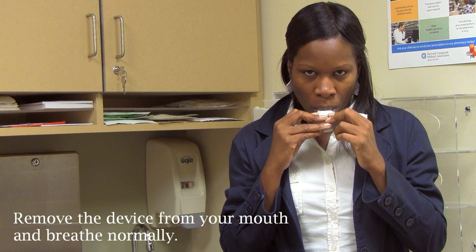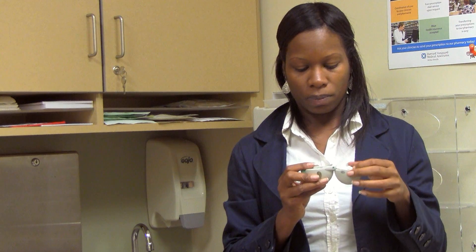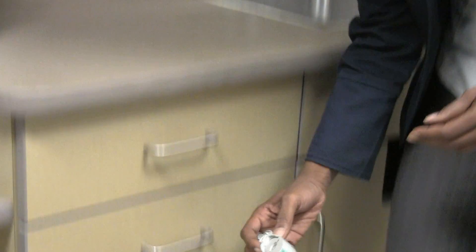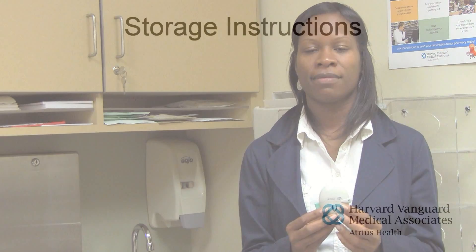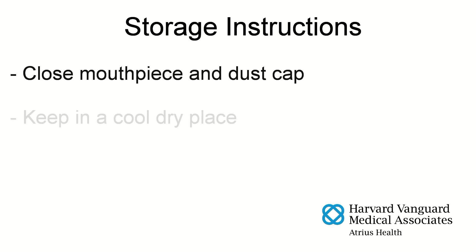After you are finished taking your daily dose, open the mouthpiece and tip out the used capsule into a disposal bin without touching or holding the used capsule. Close the mouthpiece and dust cap. Store both the inhaler and blister packs in a cool, dry place and do not expose them to extreme cold or heat.